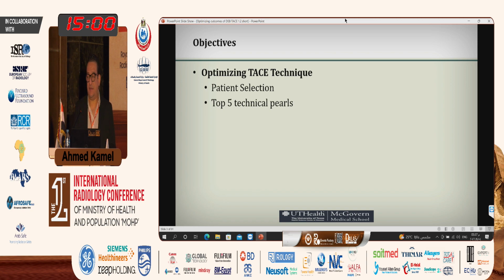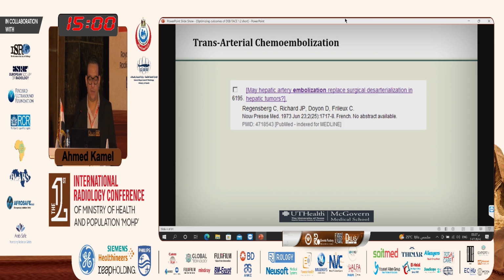To optimize the TACE technique, there's two main things that you have to do. Number one, patient selection. Without good patient selection, your outcomes are never gonna be good. So you cannot just do TACE for everyone. And there's also technical pearls for those who work in interventional that hopefully will be very helpful for them.